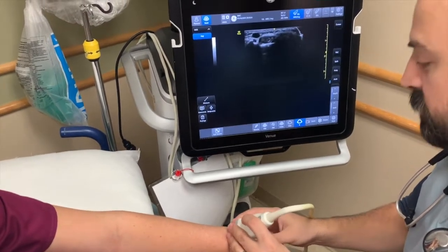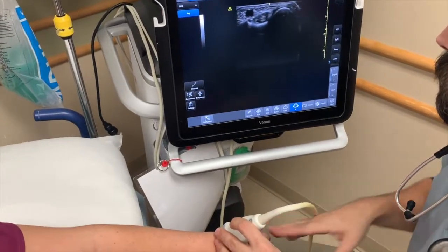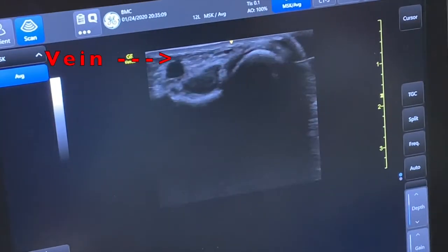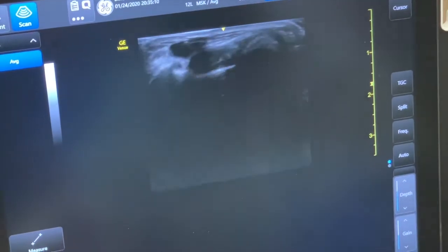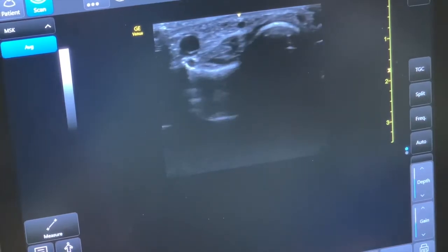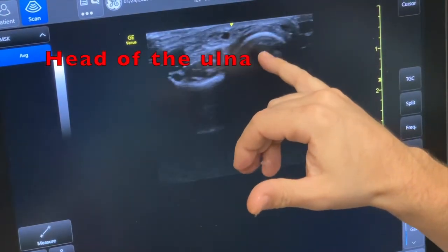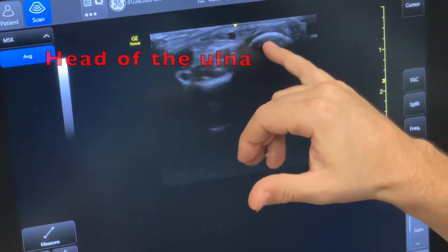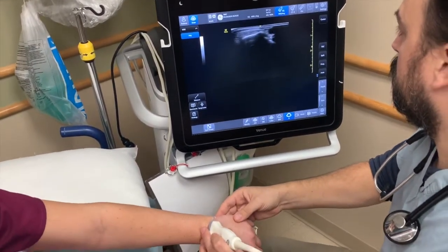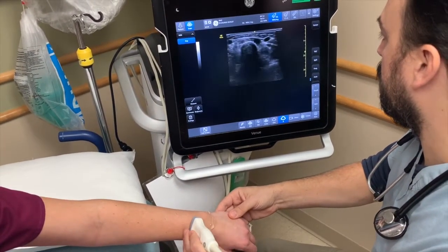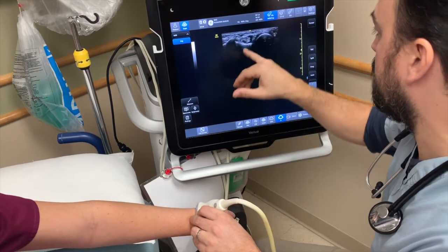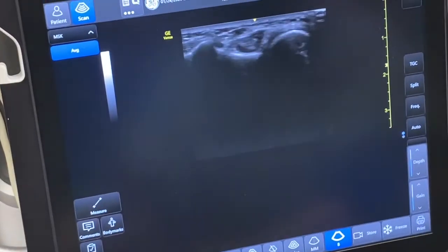Here we are on the dorsal surface now. We can see a large superficial vein there on the right. Probably the most easily identifiable structure here is the head of the ulna — the distal part of the ulna right here. Going across the other way, here's the radius. And then the extensor tendon sheath is going to be this structure here in the middle.